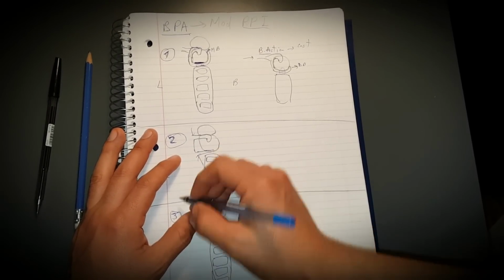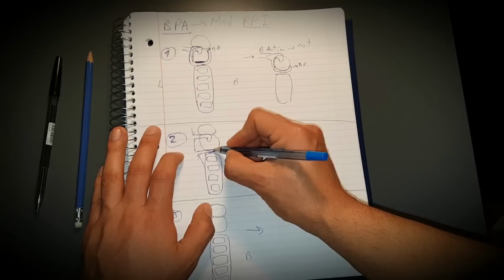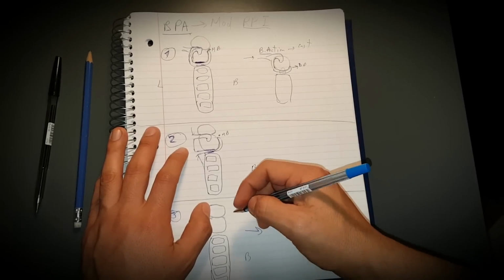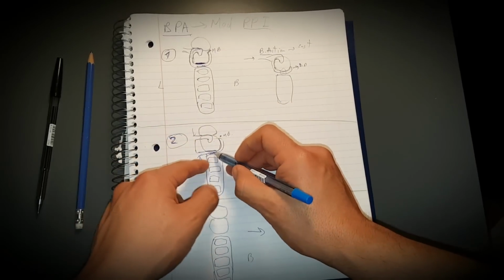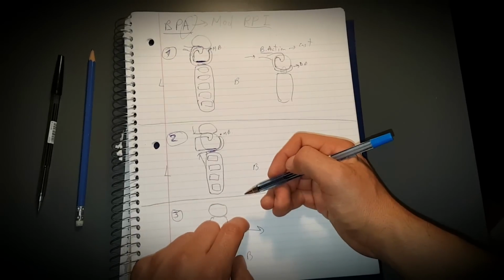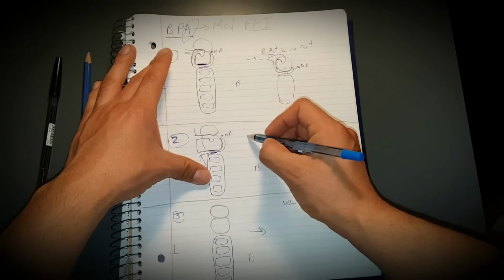From the major connector it keeps the structure, the guiding plane, and from this guiding plane it projects and continues here and engages the mesiobuccal undercut. What's this? Mesial rest, distal guiding plane, the arm. So it engages the mesiobuccal undercut. Again, both of these designs are made of cast.